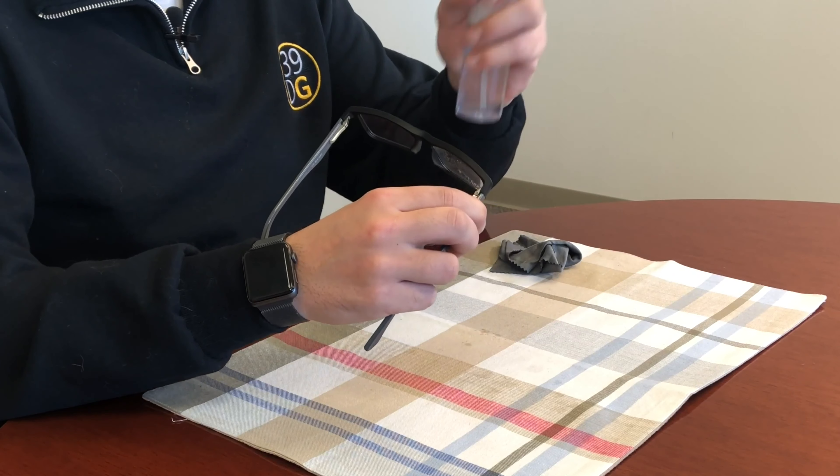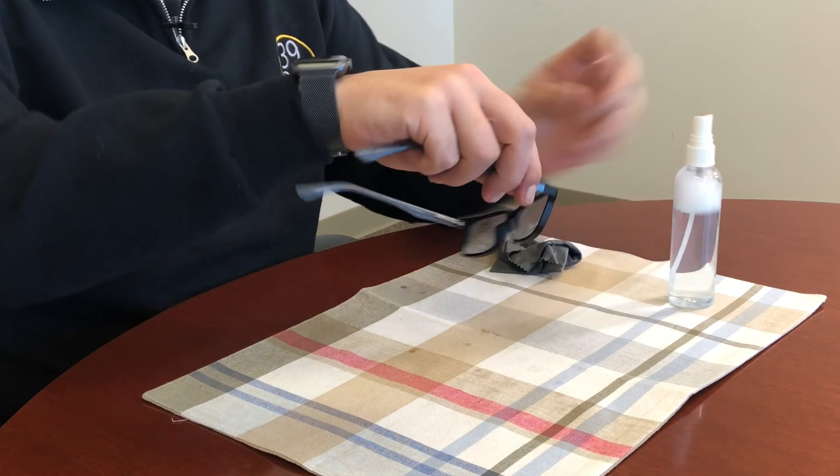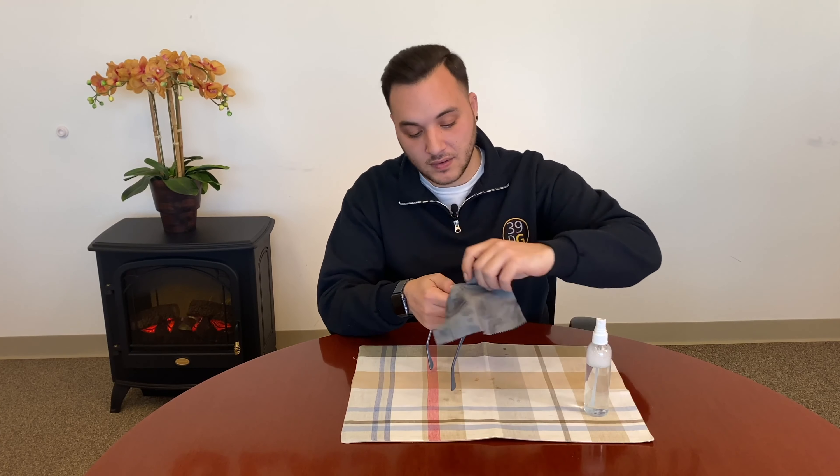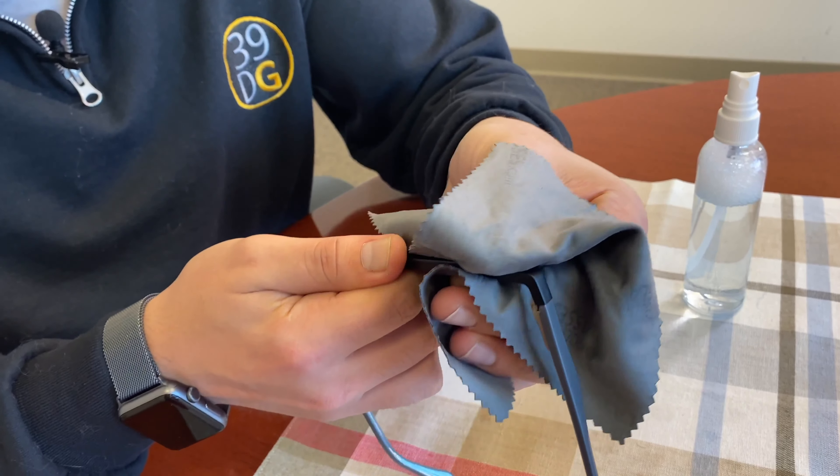The first step is going to be wetting each side of the lens. If you don't have a squirt bottle, you can mix it in a cup and pour it over the lenses. Then we're going to take the microfiber cleaning cloth and wipe each side of the lens, ensuring that they come out dry.